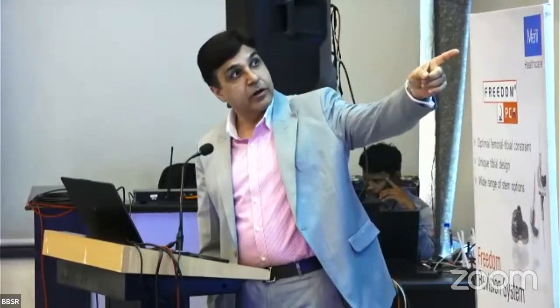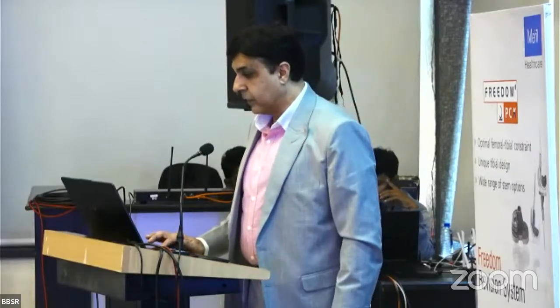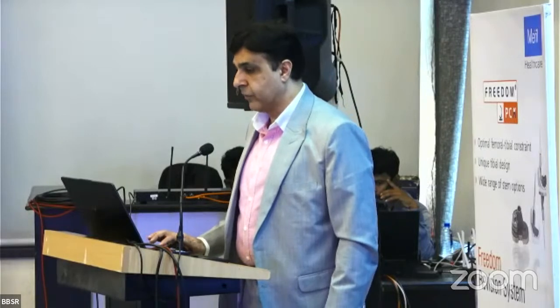Very good question. Now, these are all convex femurs. So using a longer stem would hit the anterior cortex. Look at the picture out there. Had I used any longer, I would have perforated the anterior cortex. And I'll get on with this point that you have for the opposite side. The very nice point to be gone through. We will discuss that. So till this stage, she was doing absolutely fine. She came to me and asked for a remedy for the other side also, because that had failed and was not allowing her to walk.